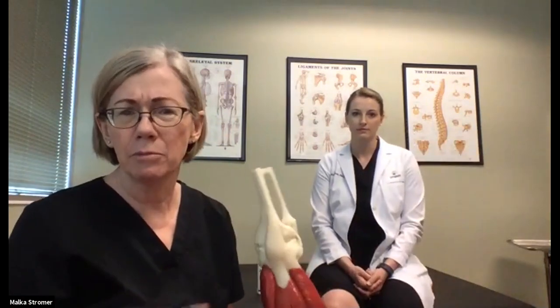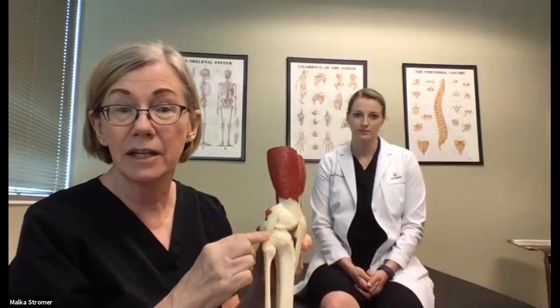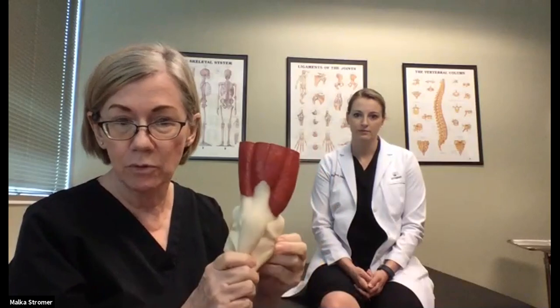Janine will get started. Towards the end of today's webinar, if you have any questions, please don't hesitate to ask. The structures we're going to look at today are the medial collateral ligament, patella tendon, the LCL and the distal IT band, the meniscus in between, and then Baker cyst in the popliteal area.